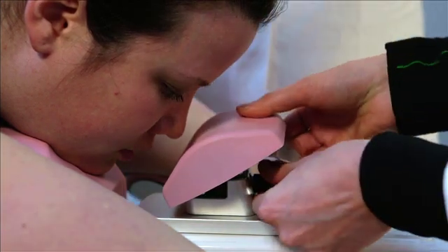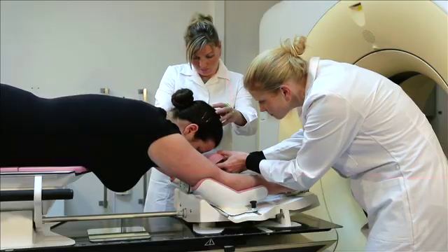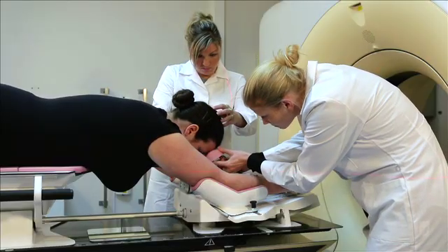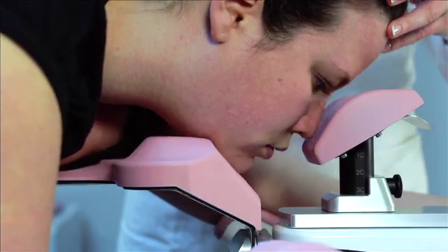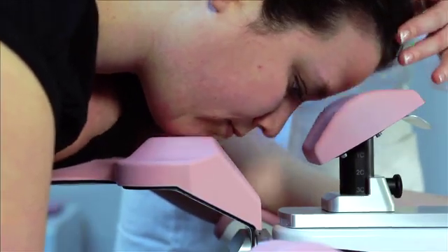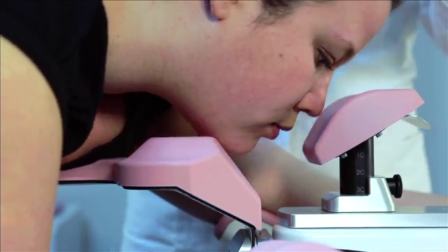The forehead support can be moved both vertically and longitudinally. Make sure the forehead of the patient rests comfortably on the support. There are two possible positions for the chin: either in the small cutout of the support or against the support.